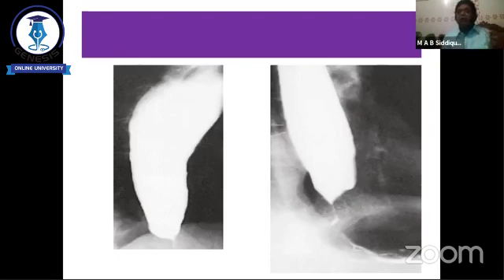If we want to see the stomach but take the X-ray immediately after taking the barium, we cannot see the stomach, but we can see the esophagus. So time is important: the ingestion of the dye, what structure you want to see, and what time it is retained in the esophagus, the stomach, and the small intestine. Time is very important.